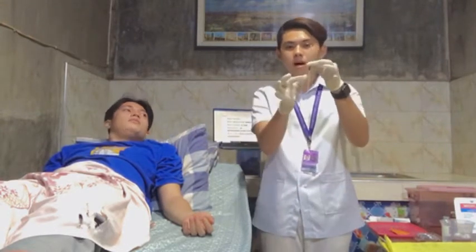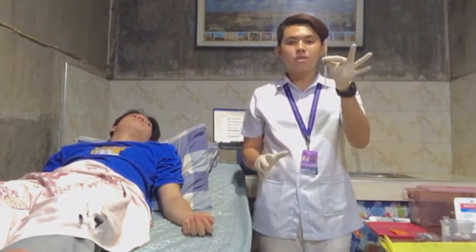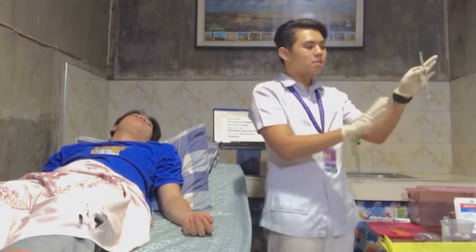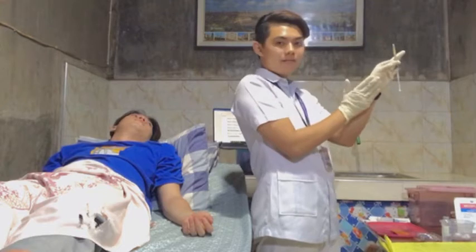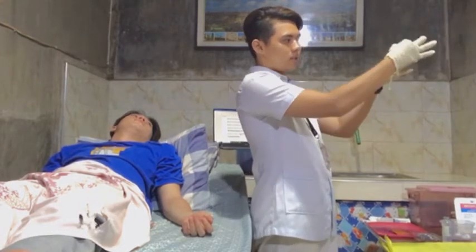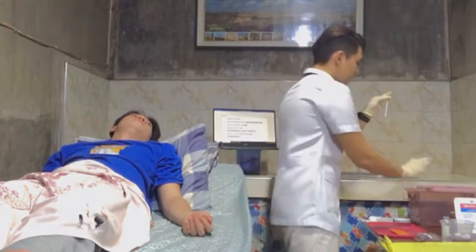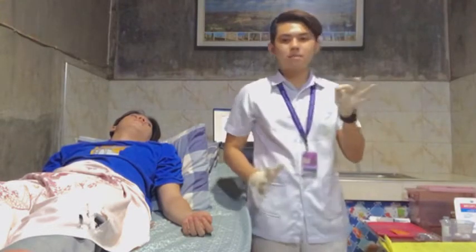So, in this, of course, we will be removing the cap and holding the syringe between the thumb and the forefinger of your dominant hand with the bevel of the needle pointing up. Since my dominant hand is the left, we will be using this one. So remove the cap just like this, and place it in the waste receptacle.